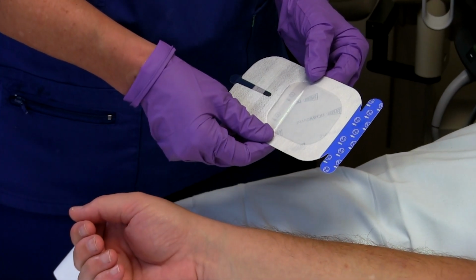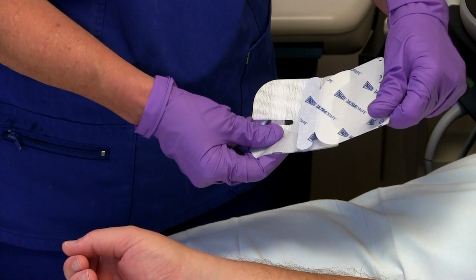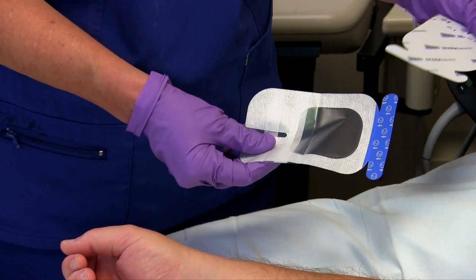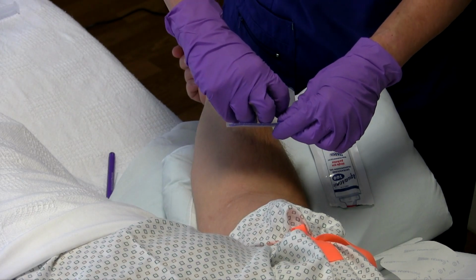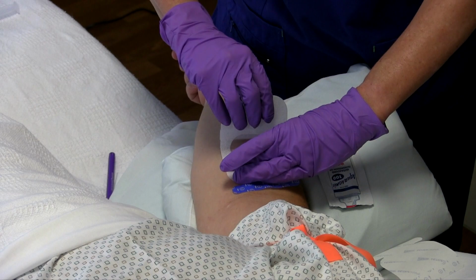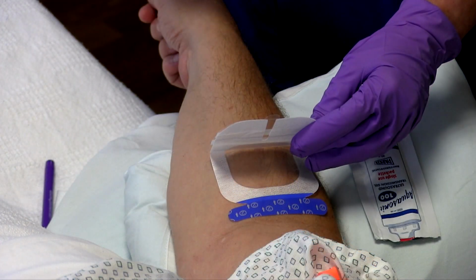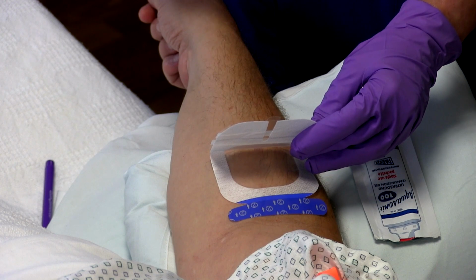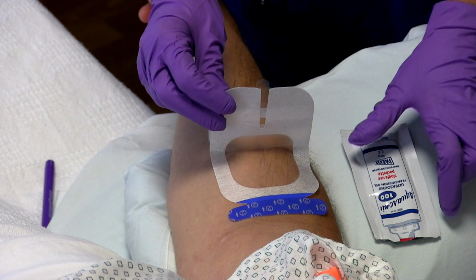Hold the Ultradrape dressing with the blue tab facing you. Remove the white paper indicated as number 1 and discard. Center the dressing above your mark. Place and adhere the dressing rear half on the skin, the part without the split. The lower half of the dressing with the split will stand upright and away from the skin and the target insertion site.